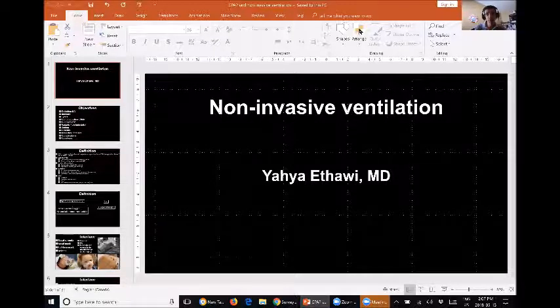When we use CPAP, almost anywhere, but it's mainly needed for transport, for the emergency department when the ventilator is not ready. We can use it in the PICU, or we can use it as a start, but also we can use it as a step down from ventilation.